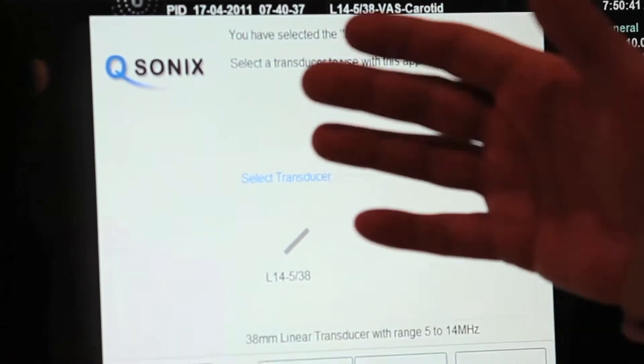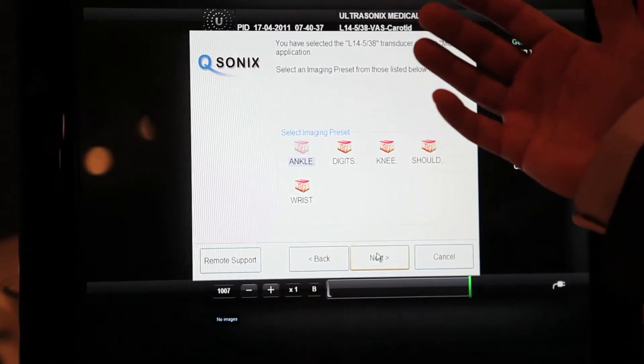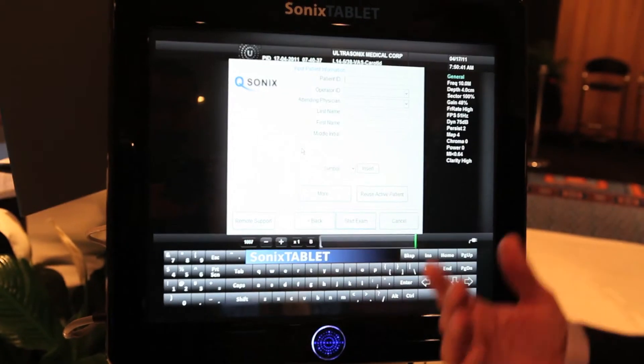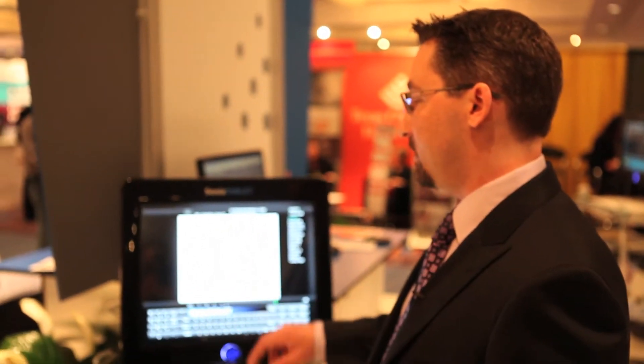If I hit the qsonics button it brings me into a very user-friendly, intuitive menu. You hit a single button and the system asks you what kind of exam you want to do. You can take a barcode scanner and zap to get the patient ID, then move down to the operator field and zap again to get the operator ID — a couple of simple steps and you're ready to start your exam.